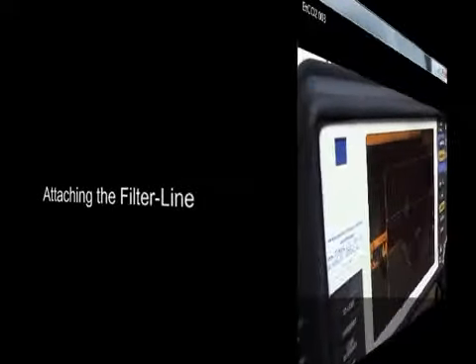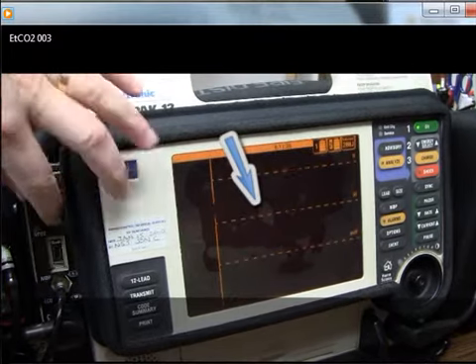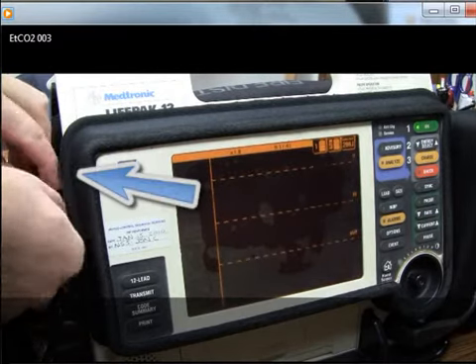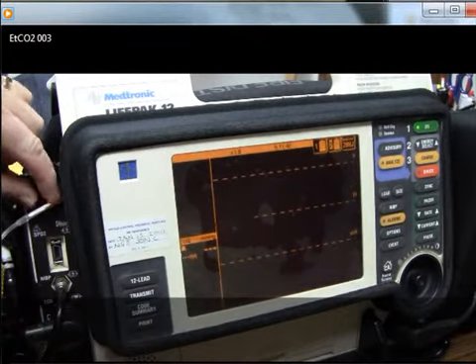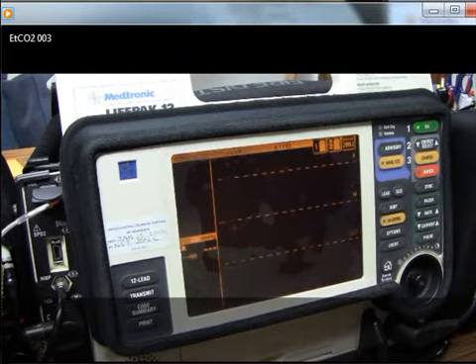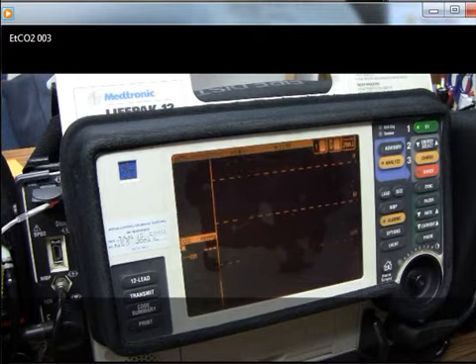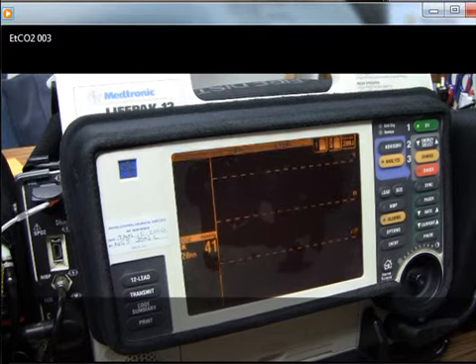When attaching an end-tidal CO2 filter line to the LifePak 12, when the LifePak 12 is first turned on, dashed lines appear and no module is highlighted that is not being used. The end-tidal CO2 module is blank until the filter line is attached and activates the module to come on. You'll notice that a value will appear in the end-tidal CO2 module area, but no waveforms exist.